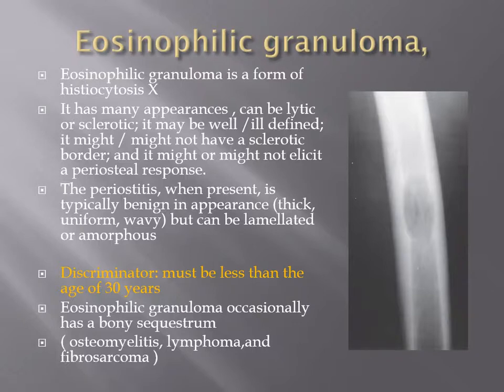First. Second, in case someone doesn't know, periostitis means periosteal reaction. When we say periostitis, we are talking about periosteal reaction. There are benign forms of periosteal reaction and malignant forms of periosteal reaction. Benign forms are when the process happens slowly.